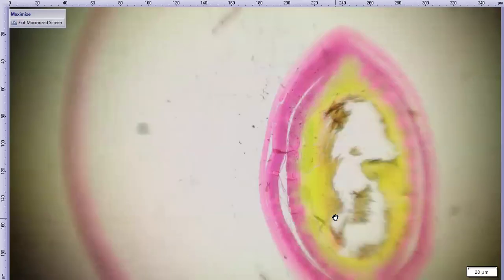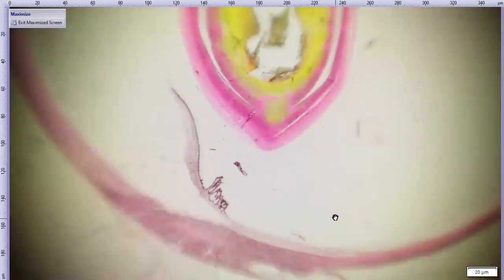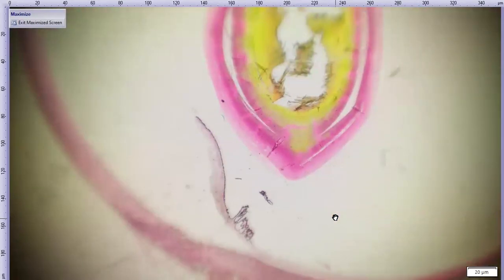So, a couple of things to pay attention to. One is the cornea. If you look at the circumference of the eye and ask yourself how much of the circumference is devoted to the width of the cornea, generally speaking, in mammals there's going to be more of the circumference of the eye devoted to the cornea. I like to call that a picture window cornea to let more light in.